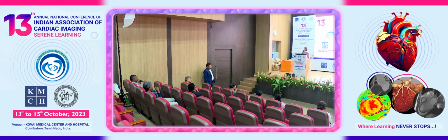Even in the literature, it says as the vessel diameter reduces, you can't make any treatment plans based on what we see. So, to save money, do you only send proximal lesions then?